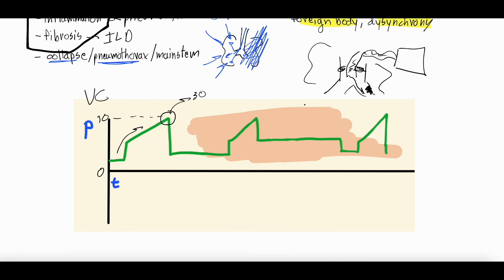This here is the plateau pressure, right, this portion of the inspiratory hold. So that is literally on the scalar will give you a pressure. You know, if this is 30, let's say maybe this is just 20. Nice normal plateau pressure. And it will kick this out on the screen too. There will be a little area that says plat, and then it'll give you a number like 20. But you have to do the inspiratory hold, right? You have to hit the button.